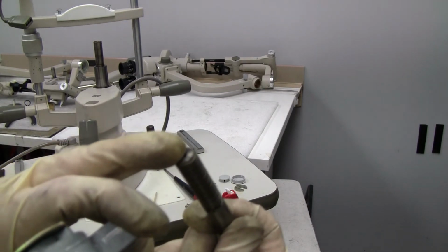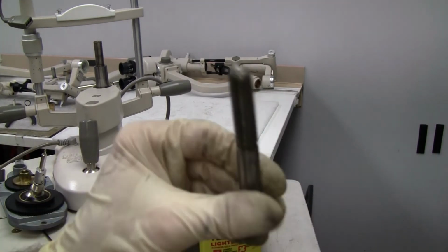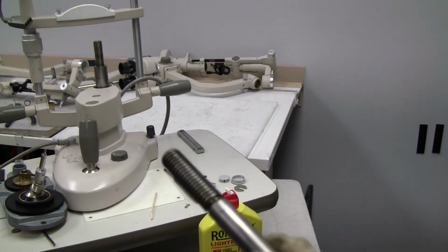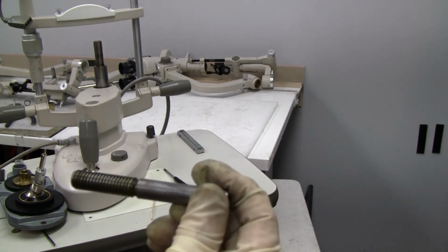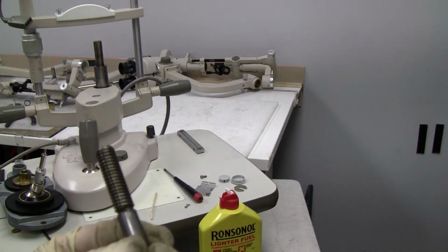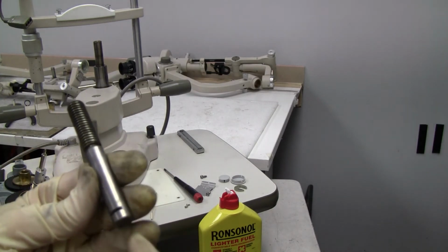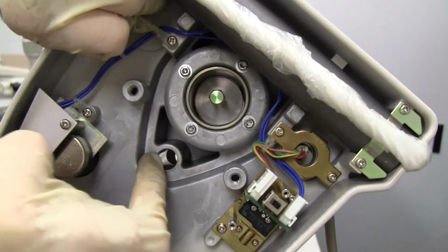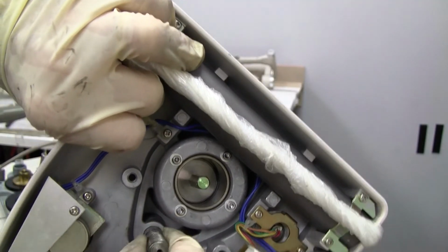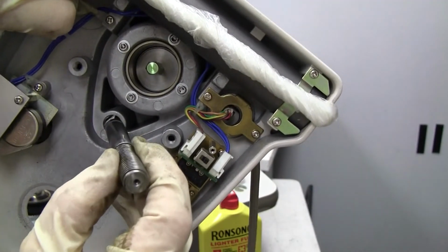Since you've taken that washer off, you can unscrew this and clean it with the brush. And then when you re-lube it, you want to use some very thin grease. I'm using a Hog Strike number 10, and that's a very thin grease. And I use it on that and on the shaft. And you want to clean inside here too, where your shaft is going to be moving. Clean that and re-lube that with a thin grease like number 10.